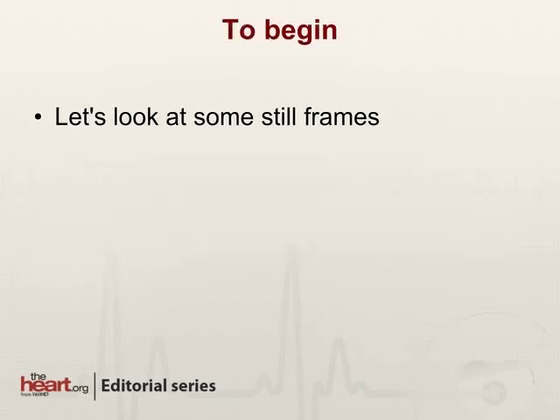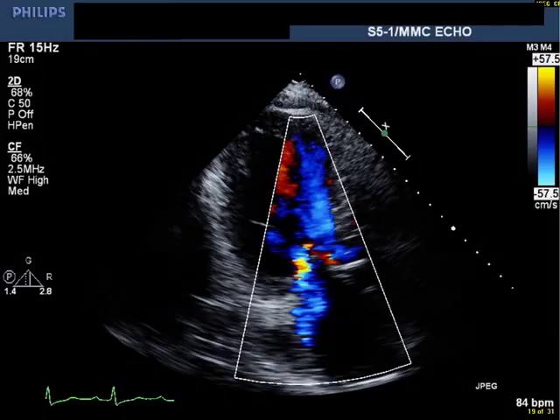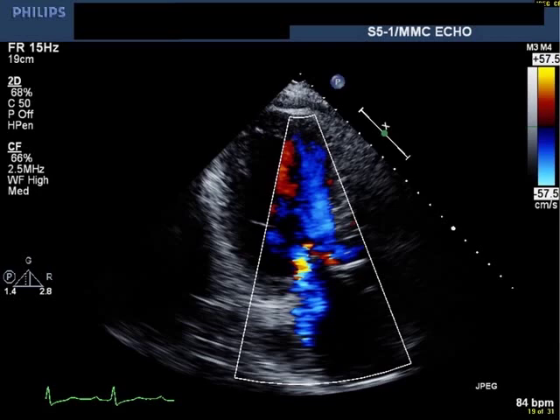Before we decide, let's take a look at some still frames from the same patient. This is a still image taken from the very image that you just saw when it was moving. You'll notice that I have frozen it on a frame that shows a very impressive mitral regurgitation jet. However, if you time this with the electrocardiogram in the lower left-hand corner, you can see that we are solidly in diastole.